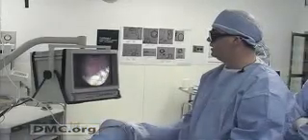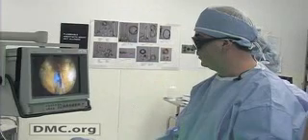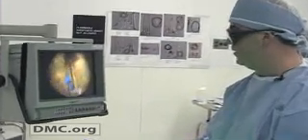When we first started, we had a completely blocking prostate, and already we've got a wide open area here. The operation isn't completed because we like to take away even more of the blocking prostate so that the patient has a really, really good result. But you can see that the operation works as promised. The laser shines, the prostate disappears, the blood loss is minimal or none. And if we look at this at the end and say, wow, that looks really wide open and there's no bleeding, we're not even going to put a catheter in, and the patient's going to go home today, no catheter.